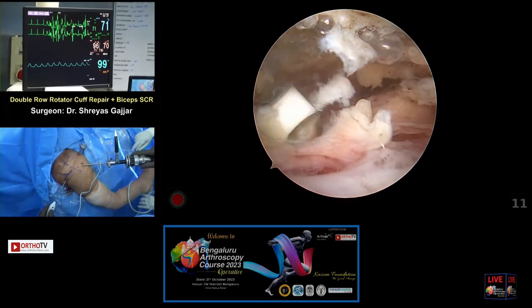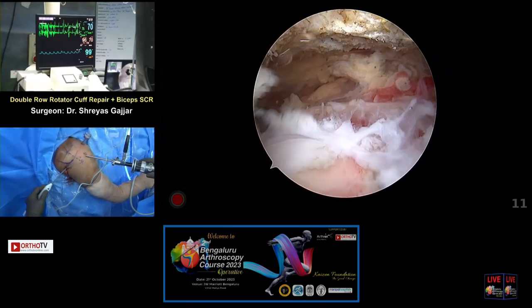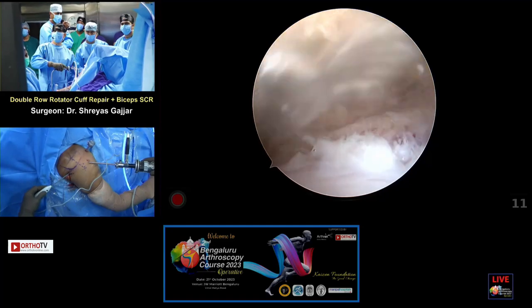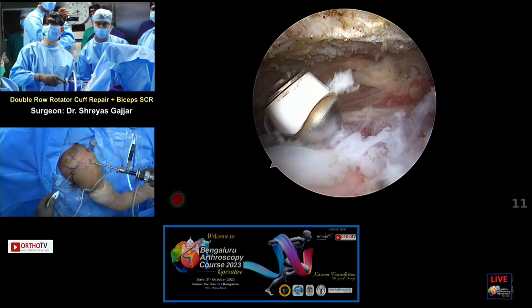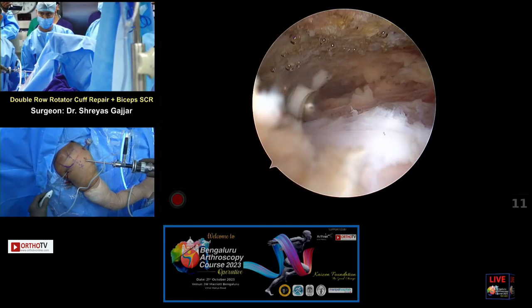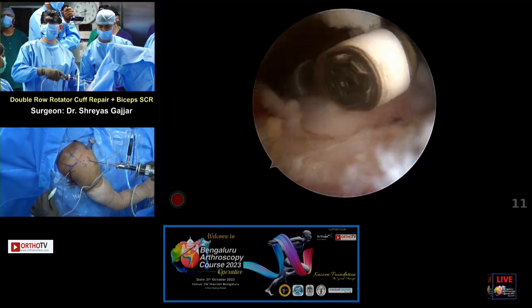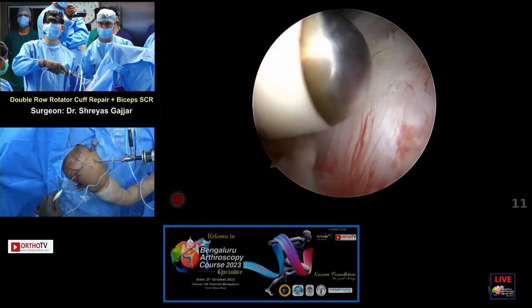Do you have any endpoint? Like till when you have to do a bursectomy? Yeah, I need to visualize the cuff properly. I just need to ensure that I have a good vision from anterior to posterior, medial to lateral, to be able to repair it, and that's enough for me. I don't do excessive bursectomy unless it really comes in my way. So I'm just clearing the subdeltoid space here, as you can appreciate.